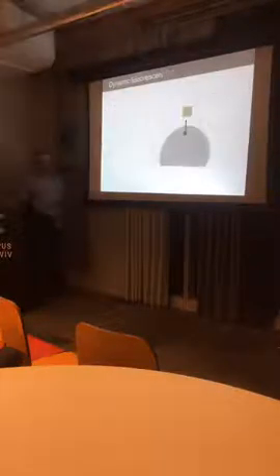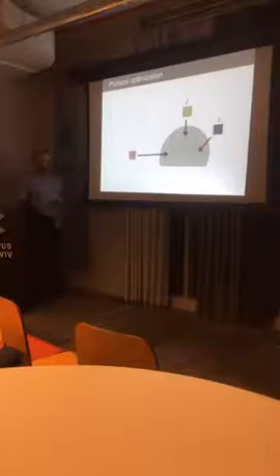We also modified this protocol using several patches on it, and then we could use 3 substances simultaneously. This is an example of the mouse here. We use 3 different substances: glycerol, which does not influence; DMSO, which is very well known in biology; and also methyl salicylate, which is used in pharmacology and in cosmetics, but it's also a mild irritant.